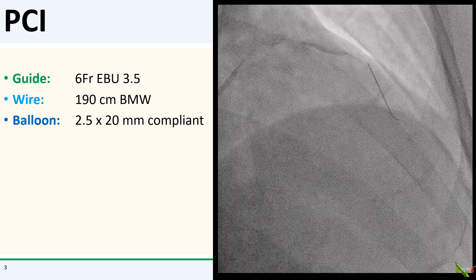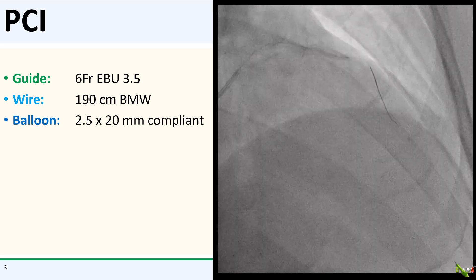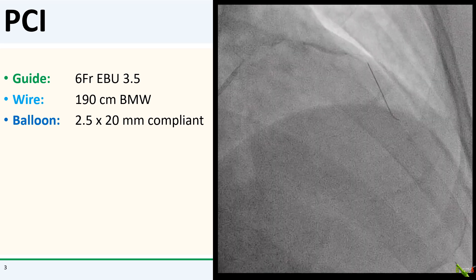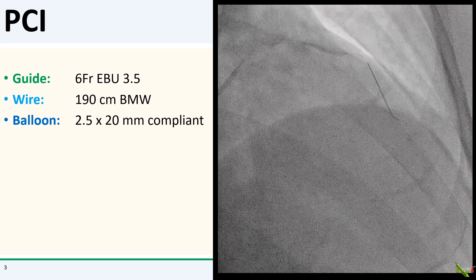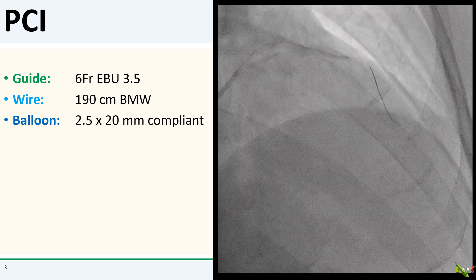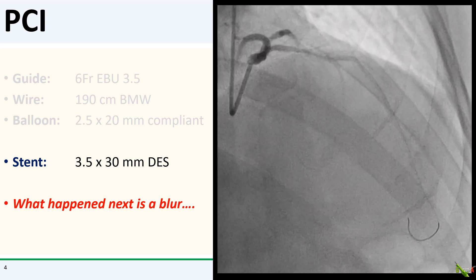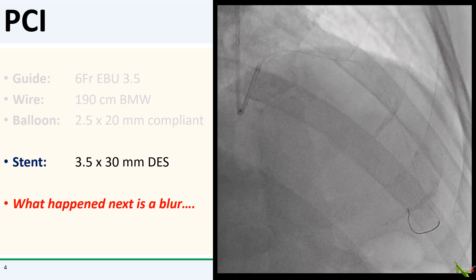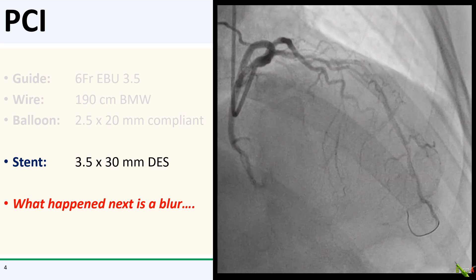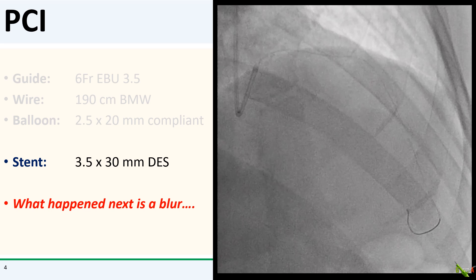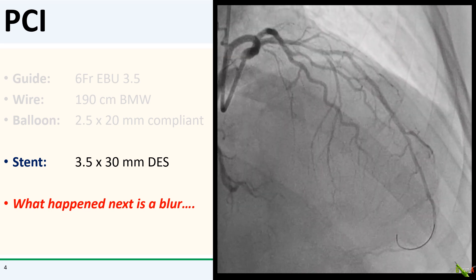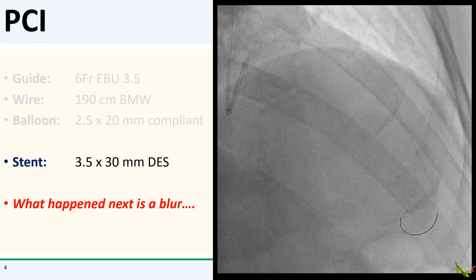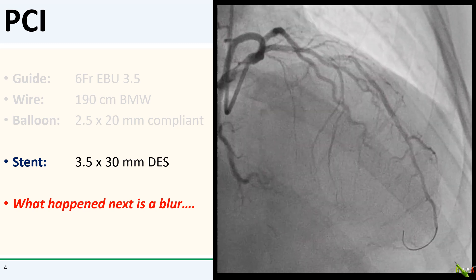Our guide was a 6 French EBU 3.5. I wired the LAD with a BMW wire and dilated the lesion with a 2.5x20 compliant balloon. This is what we had after predilation. I next passed a 3.5x30 DES, intending to deploy it in the proximal LAD.